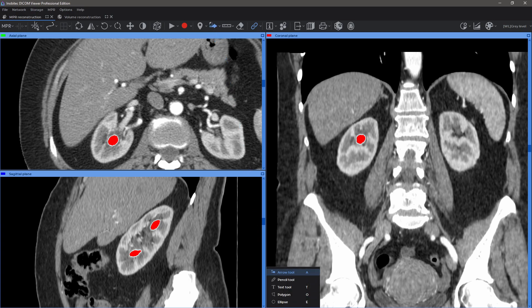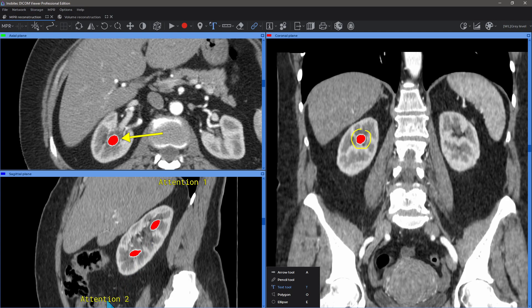Available annotation tools include: the arrow label function, freehand pencil selection, text captions, polygon stroke, and ellipsoid selection.